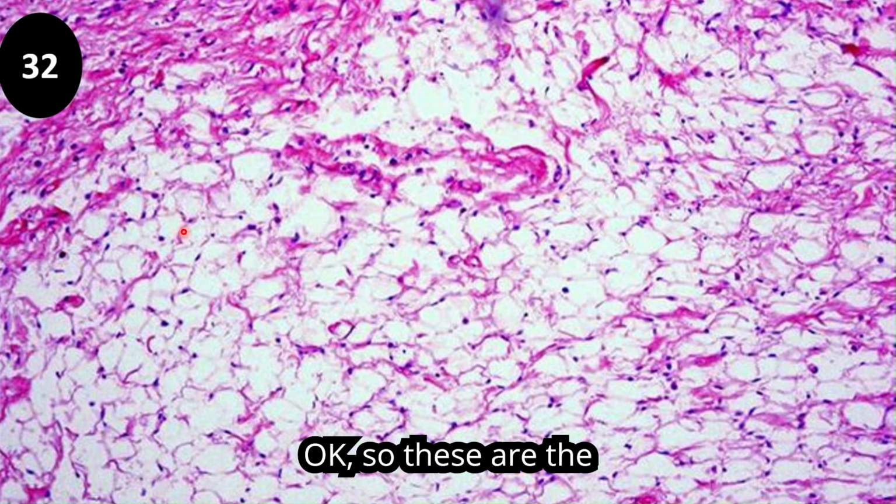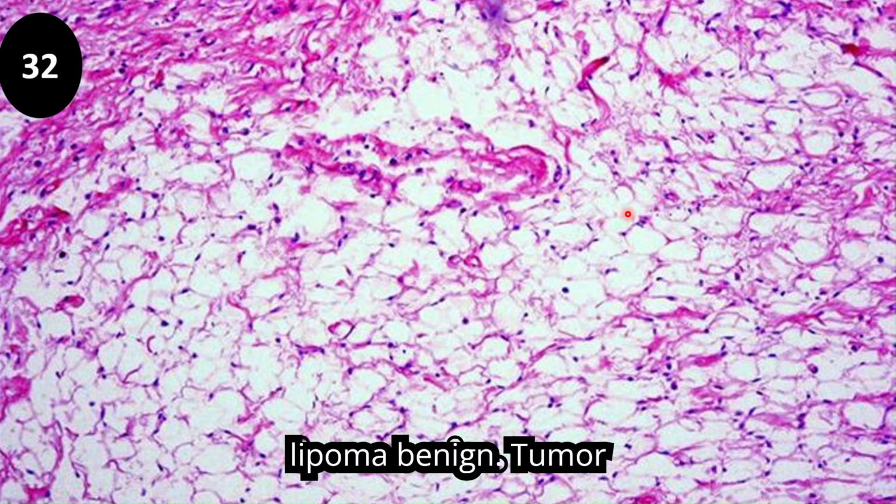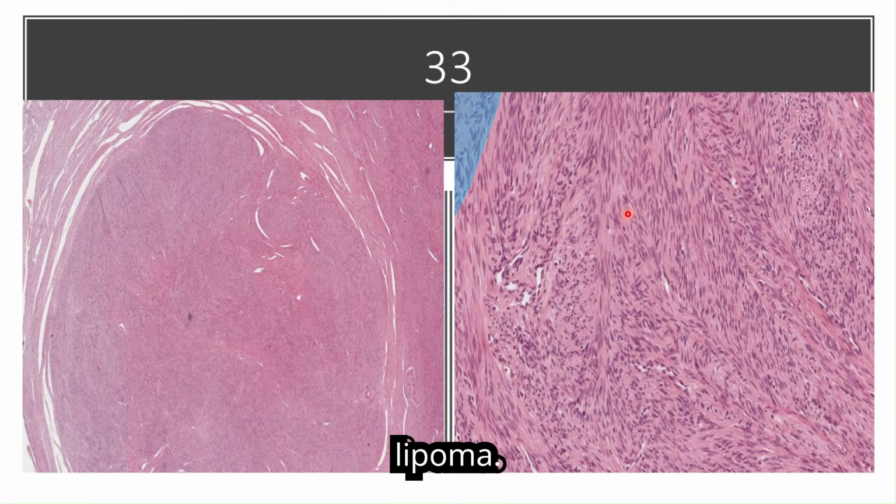Okay, so these are the fat cells. The number of fat cells is increased. So, the easiest slide in the exam, it is a lipoma, a benign tumor of adipose tissue or fat cells. So it is a slide of lipoma.